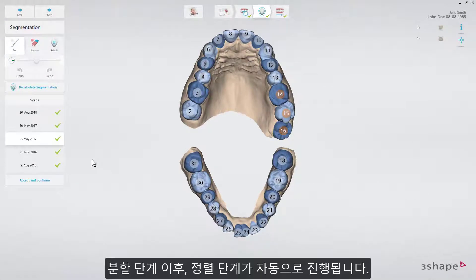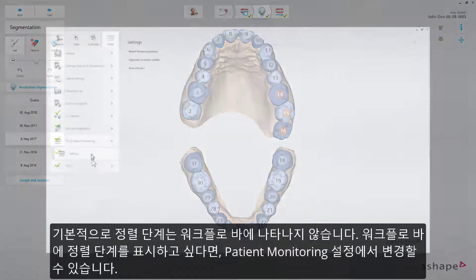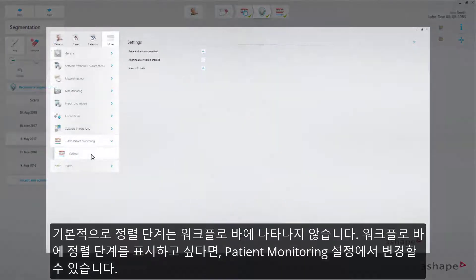After segmentation, an alignment step happens automatically in the background. Scan pairs are overlaid in chronological order so they can be compared. Alignment, by default, does not appear in the workflow bar. If you want it to appear in the workflow bar, you can enable it in the Patient Monitoring settings.